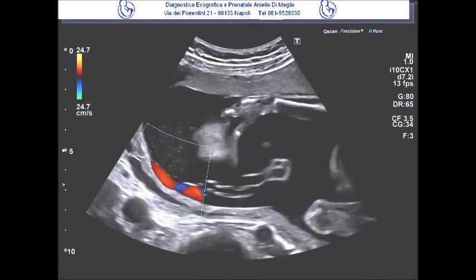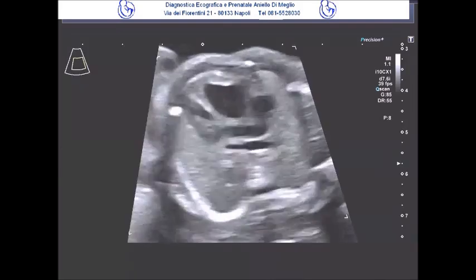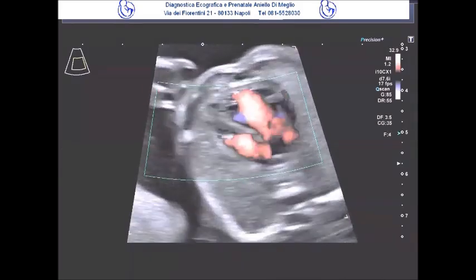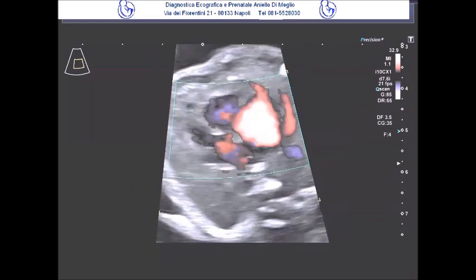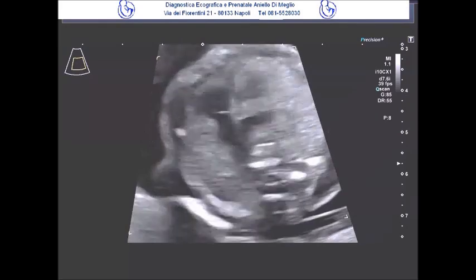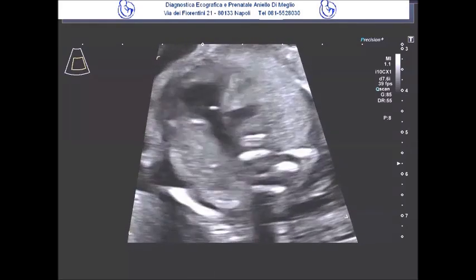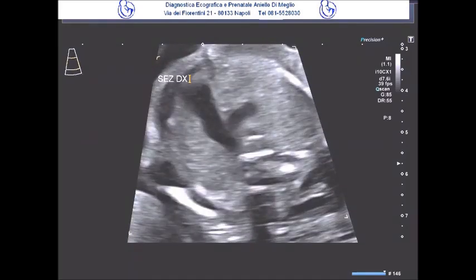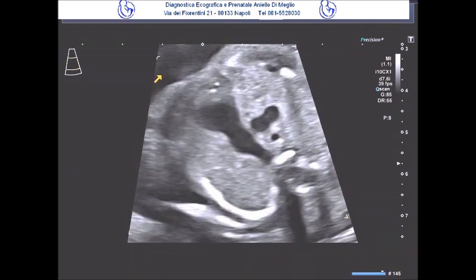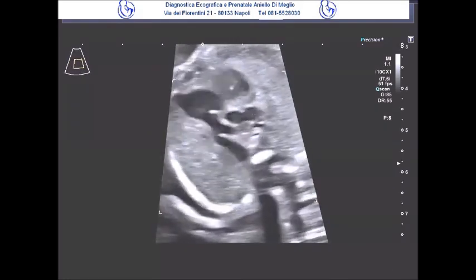In cases of umbilical vein ectasia, a cardiographic study is essential, considering the complications and cardiovascular anomalies that may be associated. In the four-chamber view, we observe a slight predominance of the right-sided chambers, which we will also see in the three-vessel view, a predominance of the right-sided chambers compared to the aorta, and a slight post-valvular ectasia of the main pulmonary trunk with a normal bifurcation into two pulmonary vessels, right and left, as we will see.